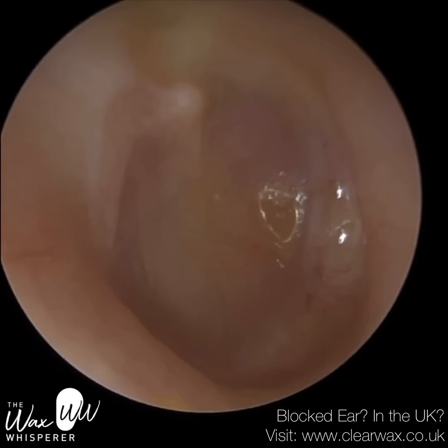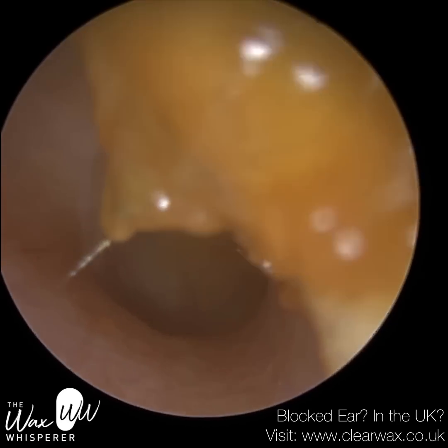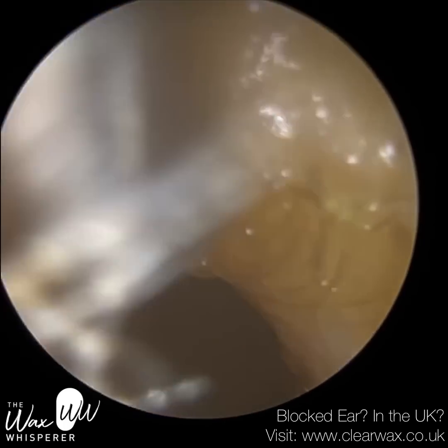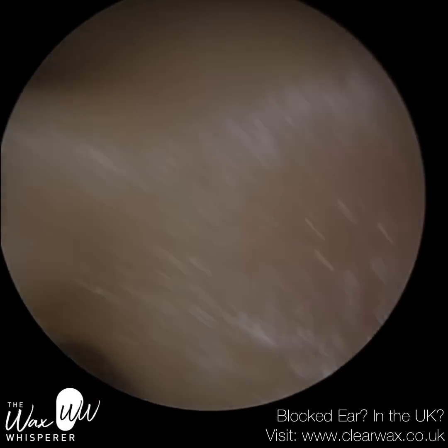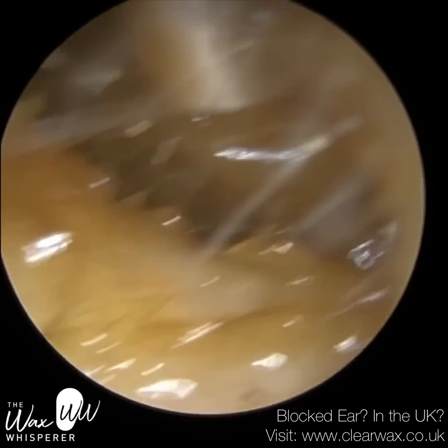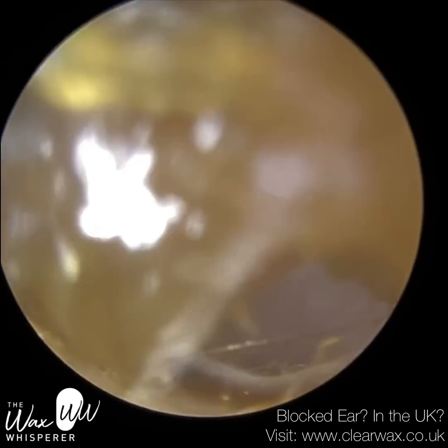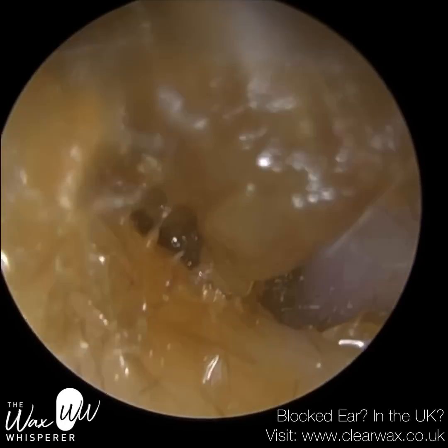Patient 2 — you can see the eardrum's very red and dull. Anteriorly there's a patch of dead skin, so they've probably had a perforation before and that's where it's healed. I'm just mopping up near the entrance. And for the same patient, this is their left ear. This wax didn't come out as easily compared to their right ear — it was a bit more of a tug of war; I had to loosen it and bring it out.